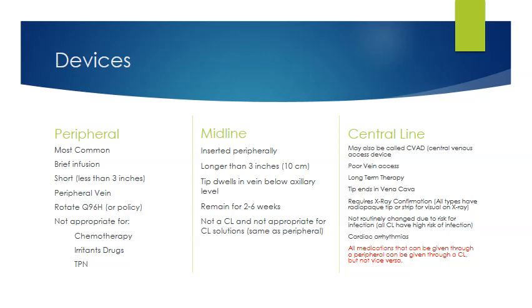And what you need to know about the midline is, as far as the insertion and the care of it, it's like a central line as far as the sterile procedure with it. But solutions that go through it are treated as if it is a peripheral. So it is not considered a central line, and you cannot put central line solutions through it, such as the chemo, the TPN, and the concentrated potassium.